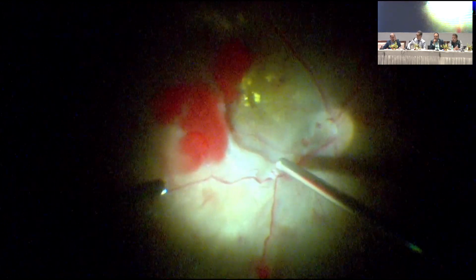Let the video run. I have one or two questions. These membranes you are seeing now while dissecting, you have a continuous membrane with multiple attachments. There are intervening areas, and you are trying to remove the whole membrane in toto. Certain times what will happen is you concentrate on one area and the other area gives way. Actually, you have seen iatrogenic break formation. Correct. So in these cases, what would you suggest? You should segment and proceed?